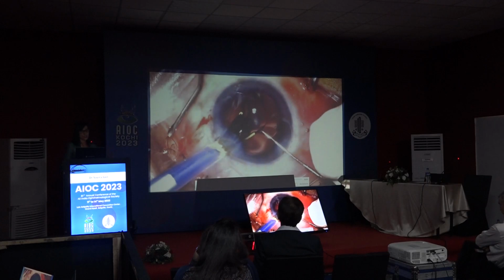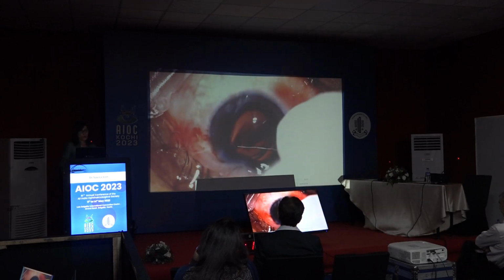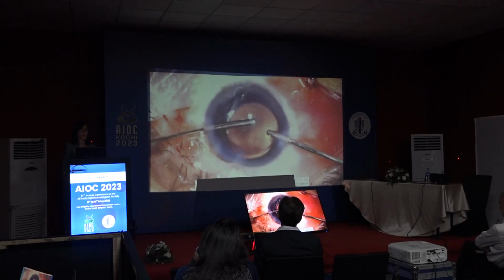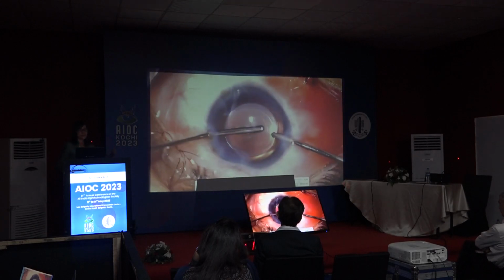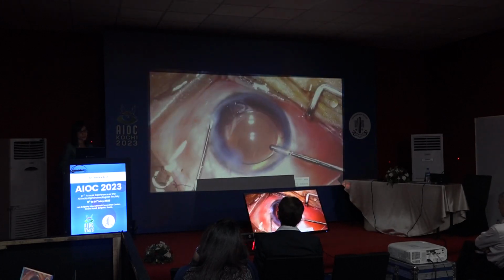Take your time injecting a lens into the eye and then carefully into the capsular bag. Once more, when you want to do your visco wash, take time to do it carefully. This is one of my slowest steps in the surgery. Avoid excessive rocking movements on the PC. In these cases, even avoid tipping up the lens and going behind it, because I want to take care that I don't end up damaging the posterior capsule at any point.